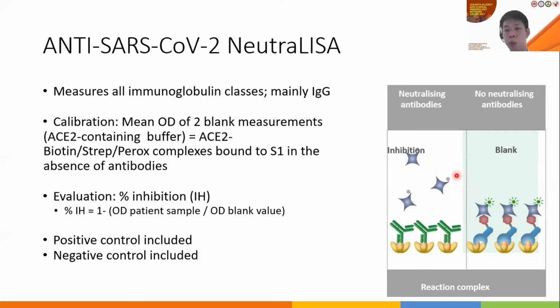In the presence of functional neutralizing antibodies, they will bind to the coated antigens that are on the ELISA plate itself. With this inhibition, there will be no signal shown through this process.